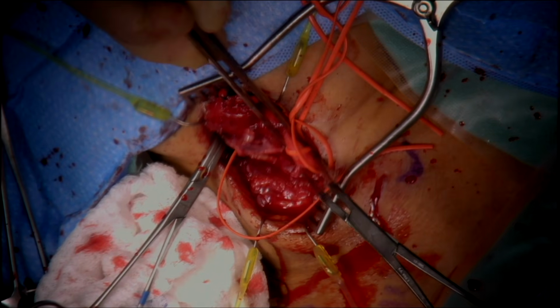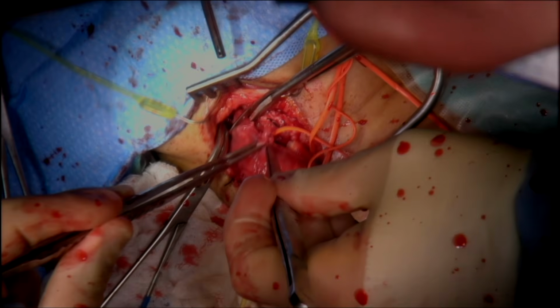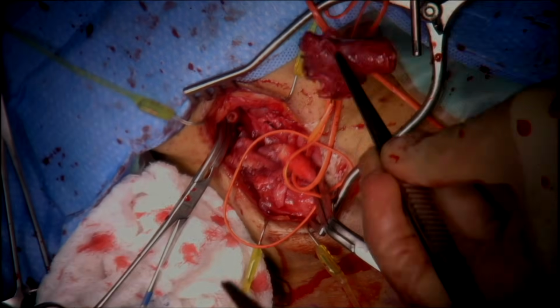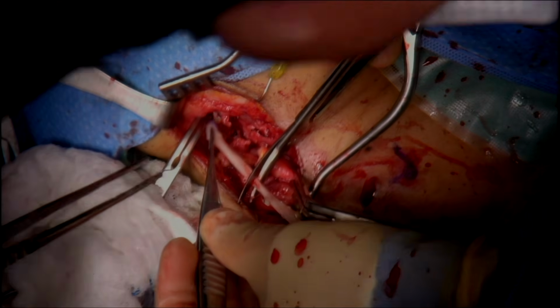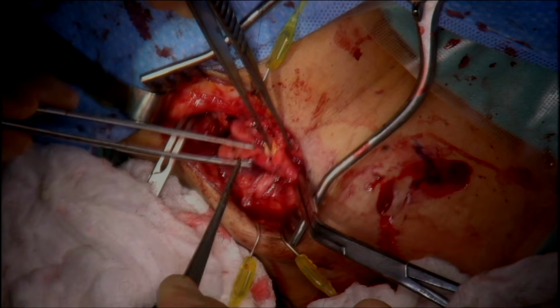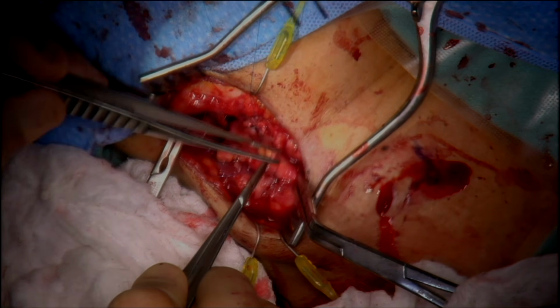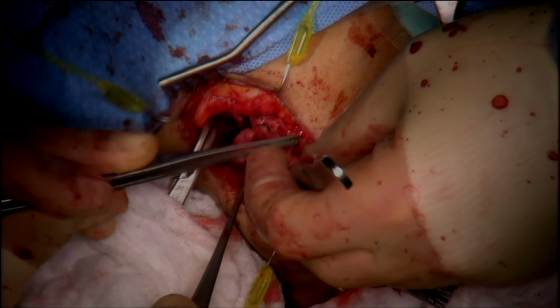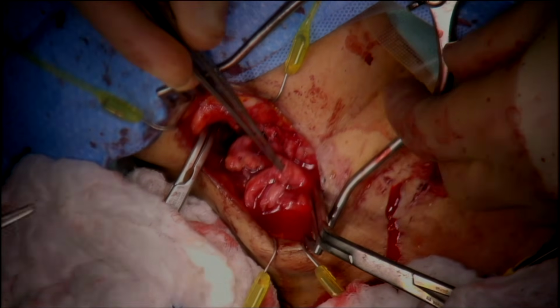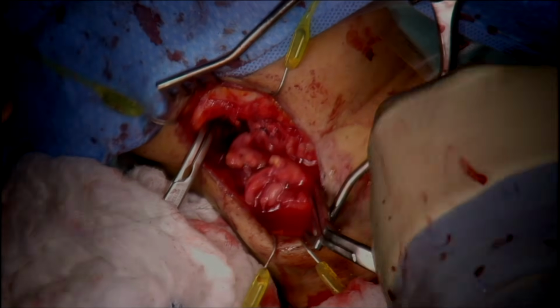And so the GSV was harvested from the right thigh, and then proximal and distal clamps were applied on the common and the internal carotid arteries. And the infected portion was resected and it was replaced by an interposition of the reversed GSV graft. The graft was anastomosed with proximal and distal anastomoses using 6-0 Prolene. The external carotid artery was suture ligated.